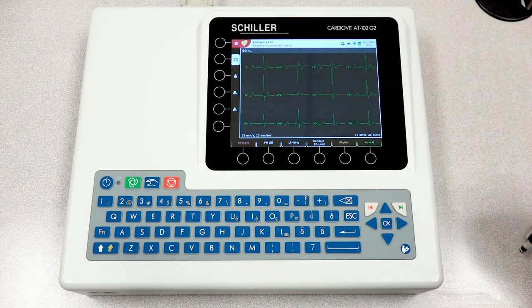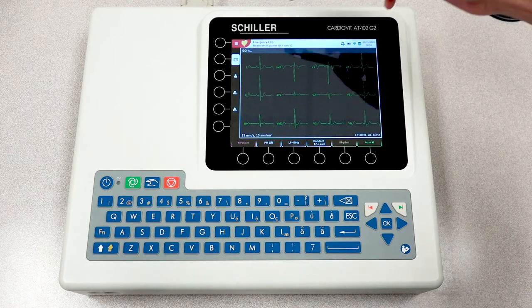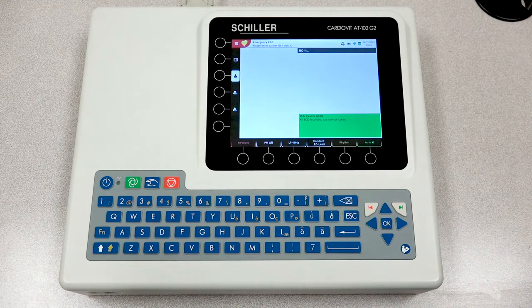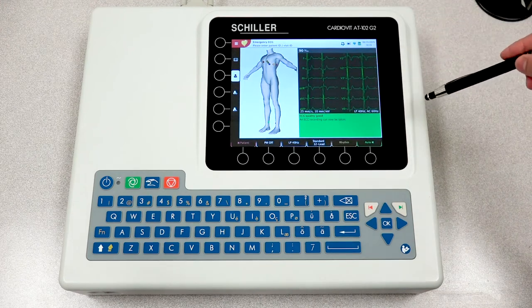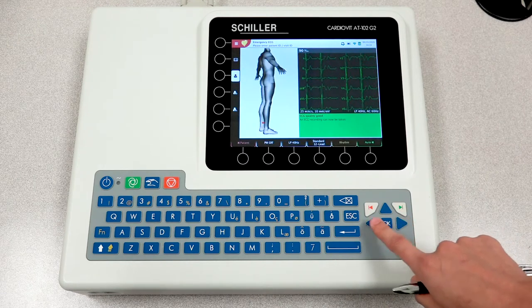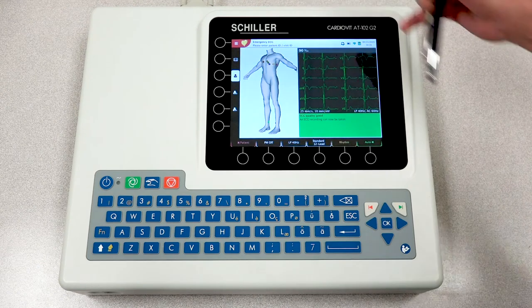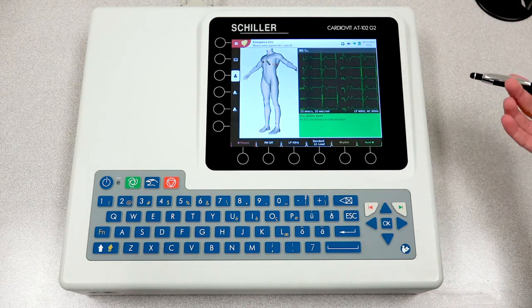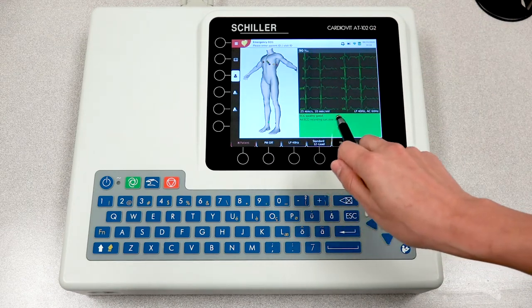You'll be able to see all 12 leads here. Verify that the signal is OK. This screen will show you the waveform screen on the right, and then you have an image of the human body which you can move side to side using the left and right arrow keys. You'll notice the lead placements, and this will also indicate the quality you actually have.